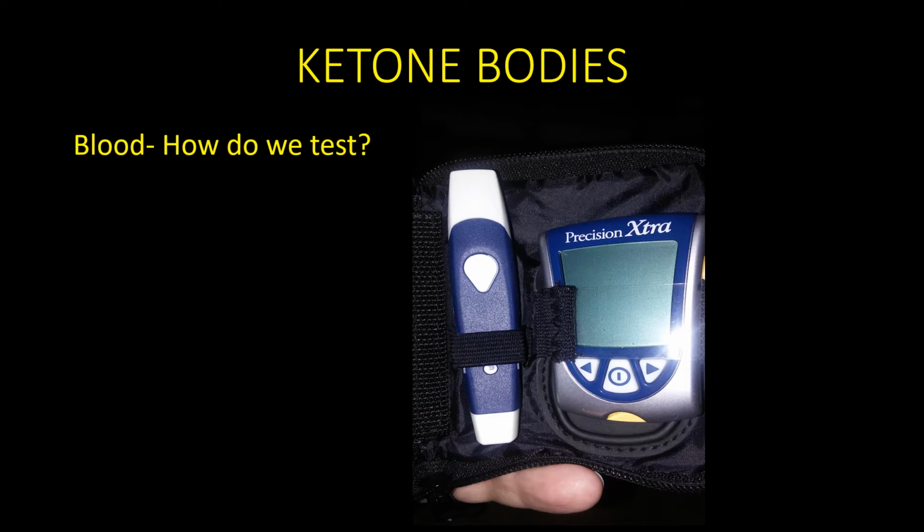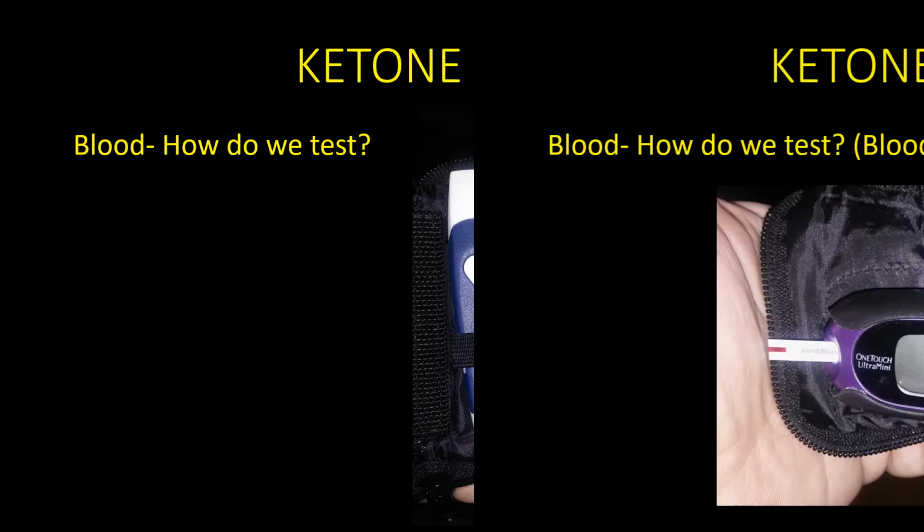And I think there's also a new brand out, which maybe I can buy one of and compare it to, because these meters can measure both blood ketones, or beta hydroxybutyrate, and blood sugar, but you've got to have two different strips, and the strips for these units are expensive by comparison. So a lot of times people will just buy the ketone test strips for this unit and then use an entirely different unit to test their blood glucose, because it's going to save you money in the long run.